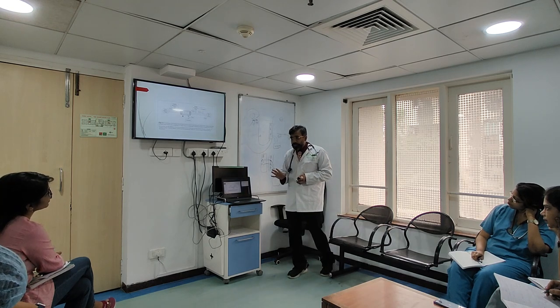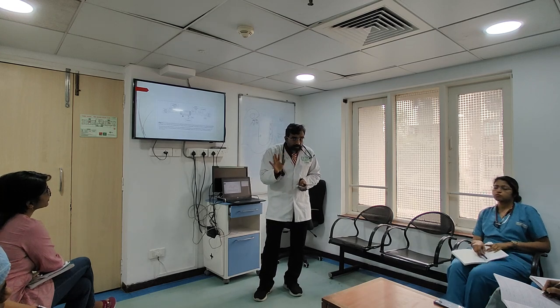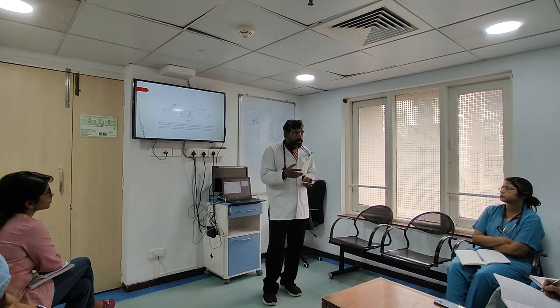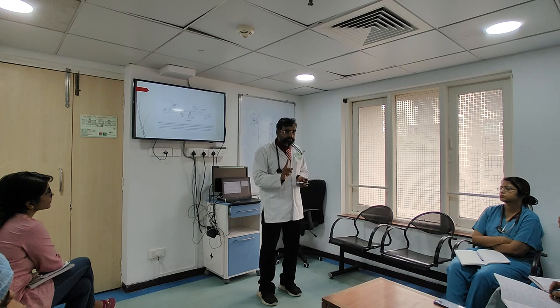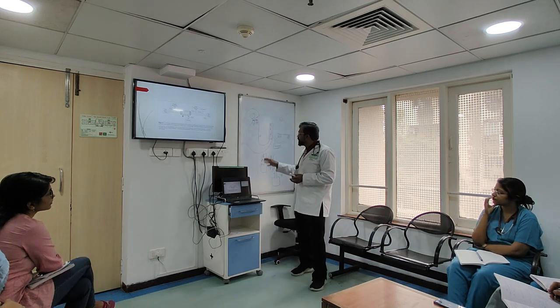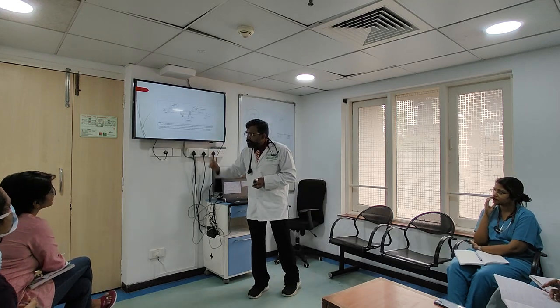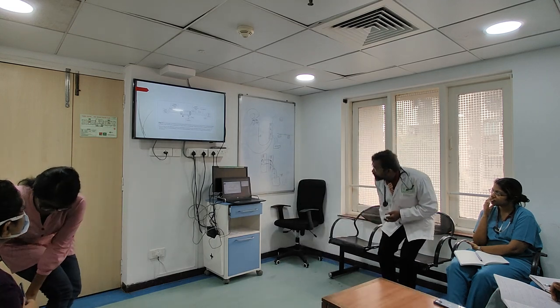Though it is not replacement fluid, it is not replacing anything. I am just calling it replacement fluid, it's maintaining it. But more importantly, if I increase my replacement fluid, what is going to happen? So where does this classically go? In this filter, she's put two diagrams. What are the two things that you put over here? Both hemofiltration and, explain, then we'll go ahead.